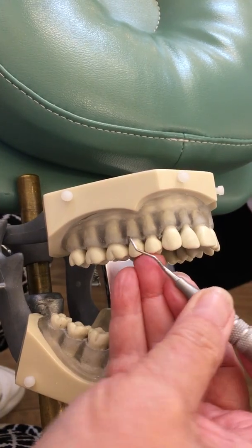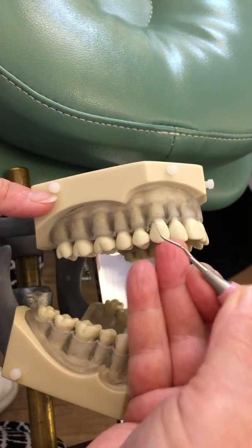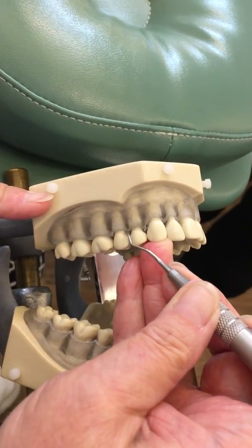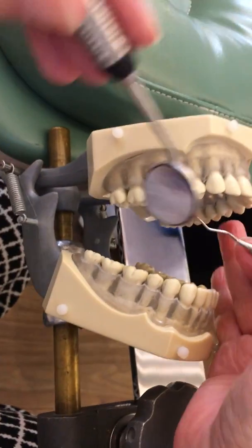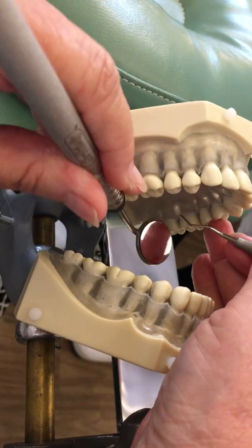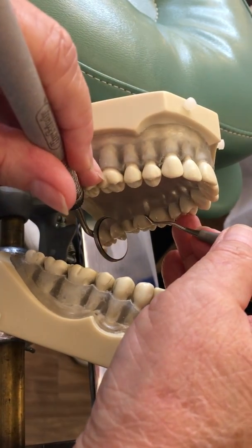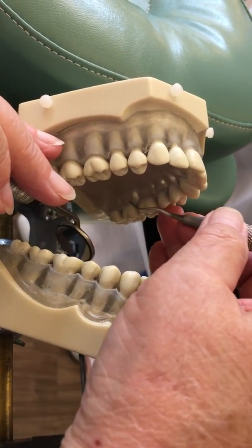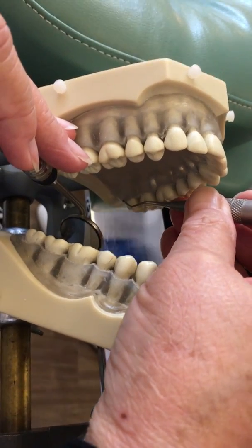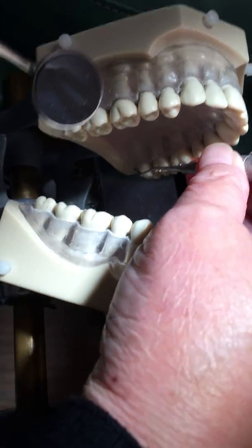We're going to continue with the premolars. Now I'm going to move to area six, and I have to use my mirror both to spotlight, to see around the corners, and also to get the tongue out of the way because the patient is going to want to put their tongue up there. The light needs to be moved this way and then pointed — the light's going to be coming over my shoulder.